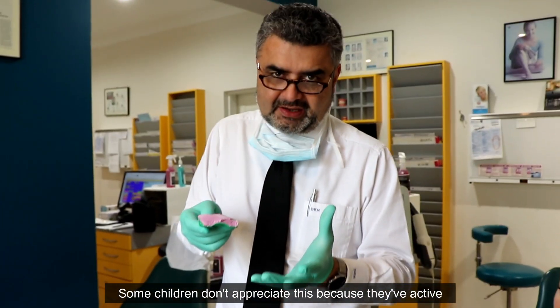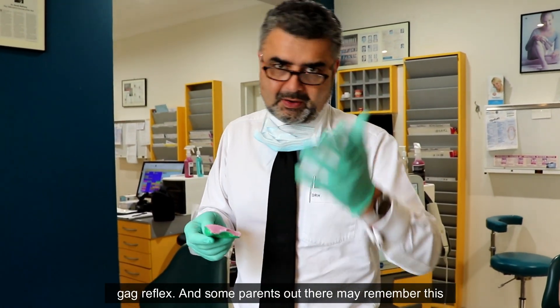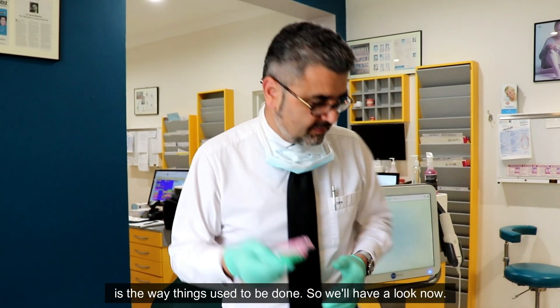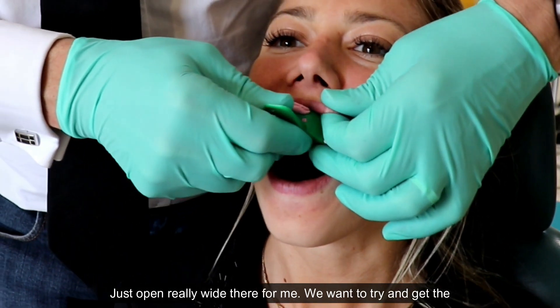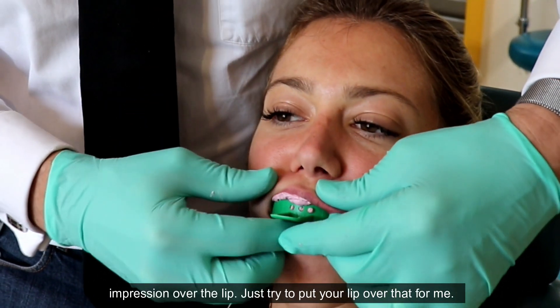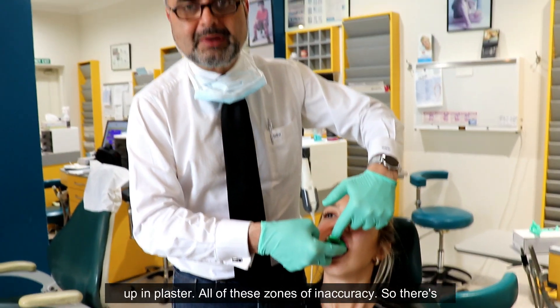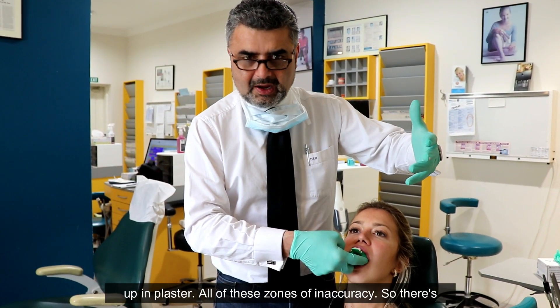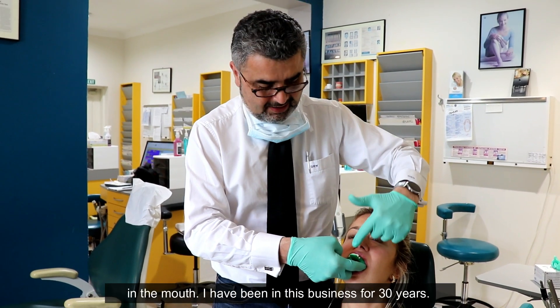Some children don't appreciate this because they have an active gag reflex, and some parents out there may remember this is the way things used to be done. We want to try and get the impression over the lip — just try and put your lip over that for me. Excellent. Then we have the ordeal of pouring it into plaster. All of these are zones of inaccuracy, so there's nothing more accurate than actually doing a one-to-one digital scan in the mouth.